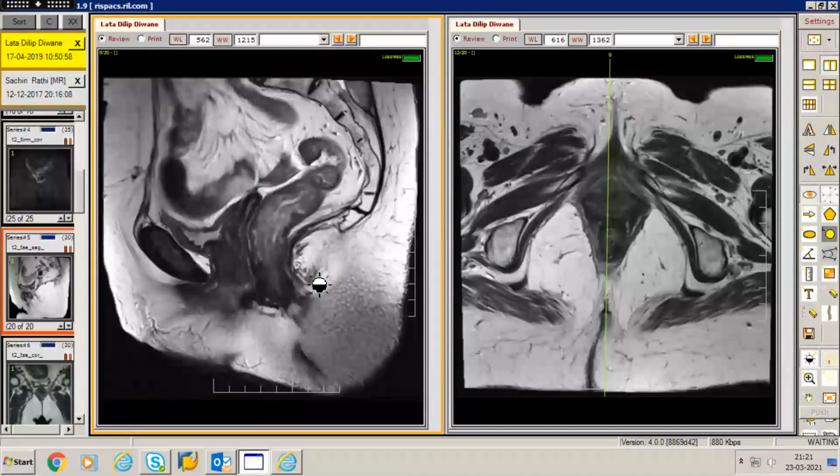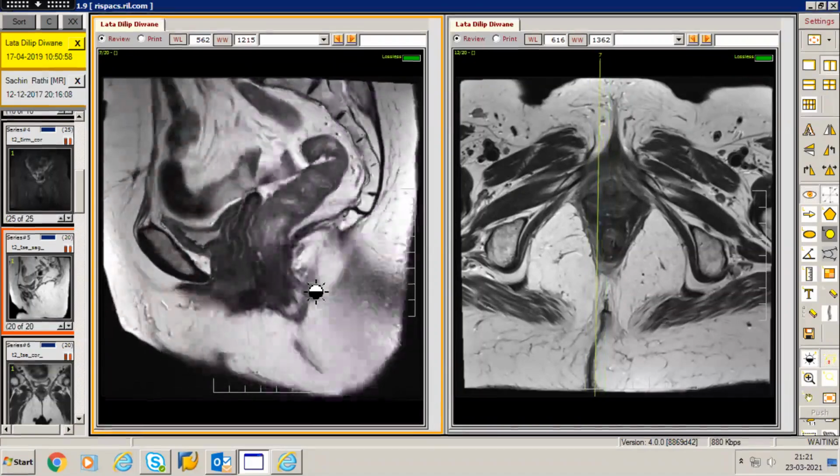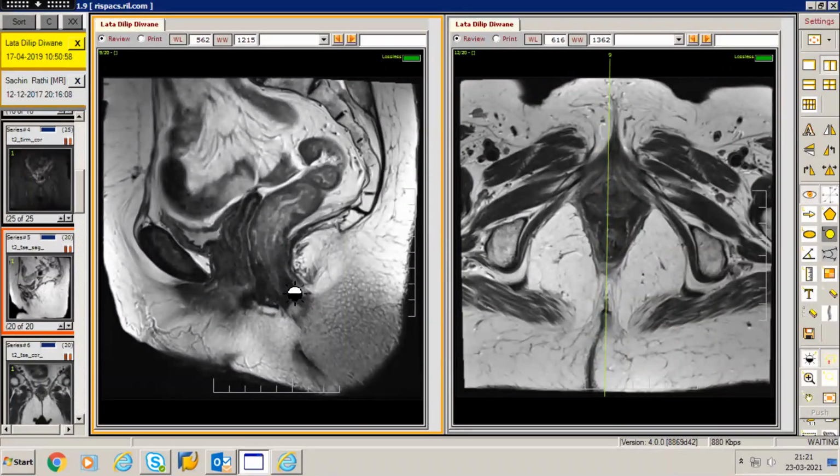Again, for us to understand the same thing about the sphincter mechanism, on the sagittal image you would have the external anal sphincter located over here. This is the location of the anal verge, and the internal anal sphincter, which is formed by part of the circular muscle of the anal canal itself.